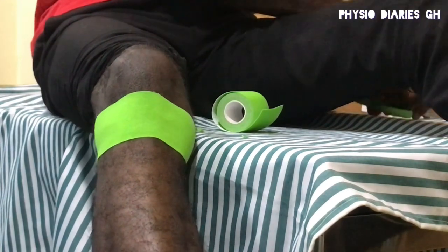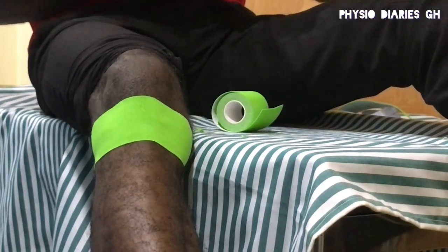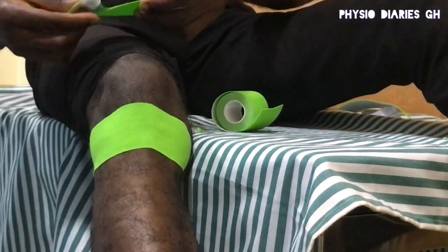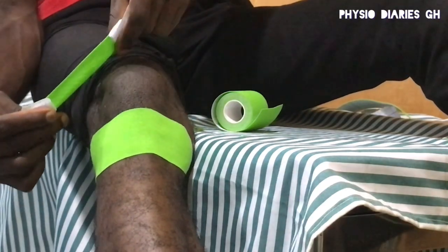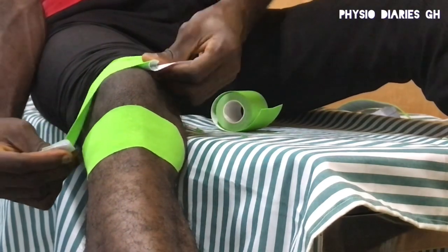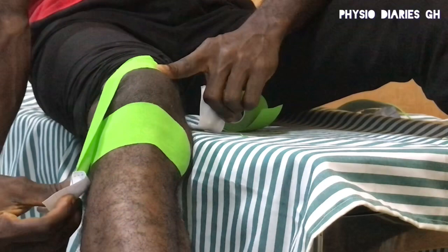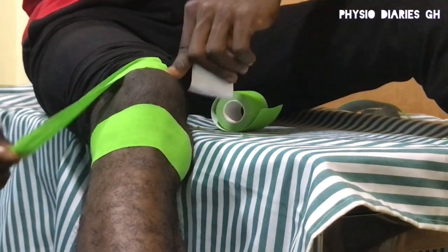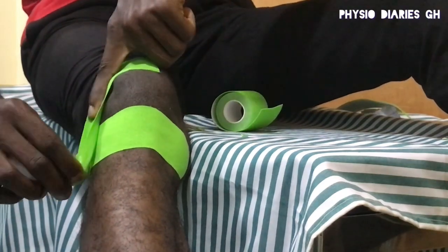Begin to prepare the other 2 for the application. By tearing the end of the tape, apply to the thigh just above the kneecap with no tension. Stretch the strip and begin to apply around the knee joint, covering the lateral epicondyle and overlapping the first one already in place.